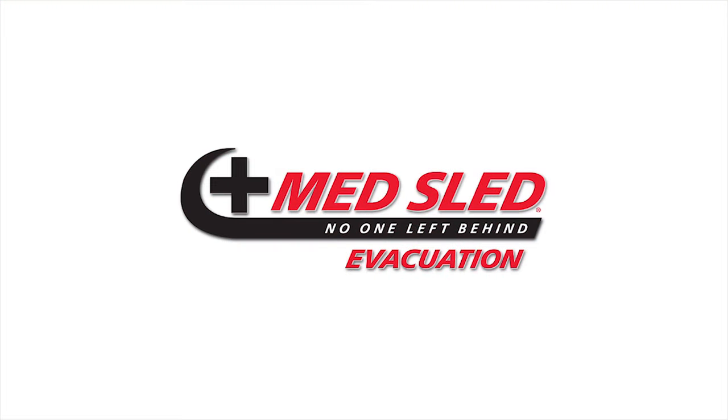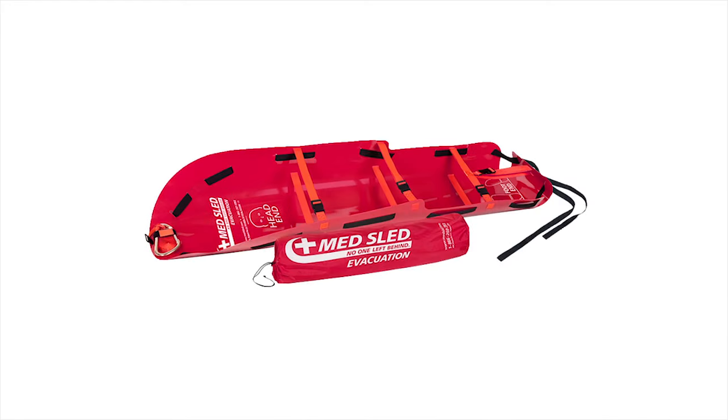Thank you for choosing the MedSled Evacuation Sleds as your preferred emergency evacuation device. When timing is critical, the MedSled Evacuation Sled enables your staff to safely transport a person two to three times their weight over debris, out of a single story or down stairwells of a multi-floor building, without ever lifting the patient.